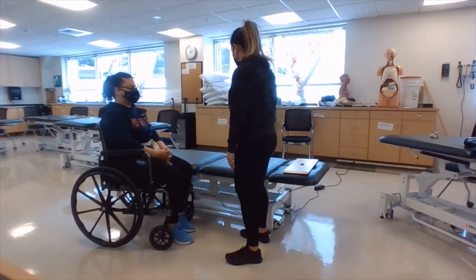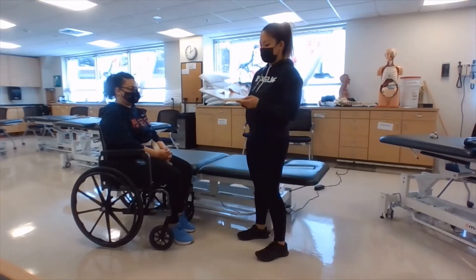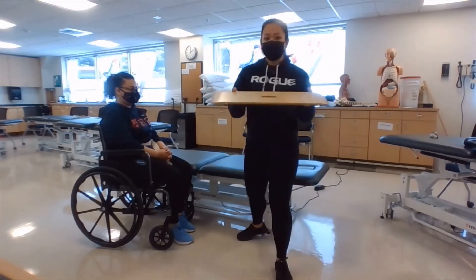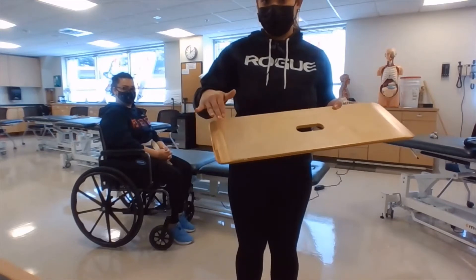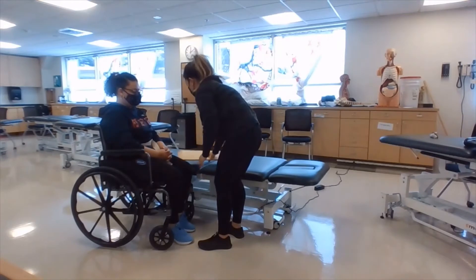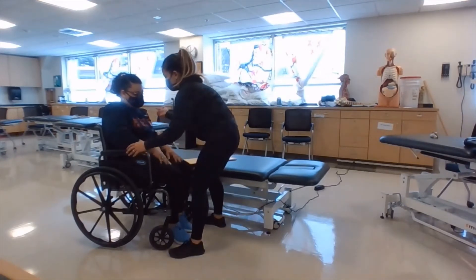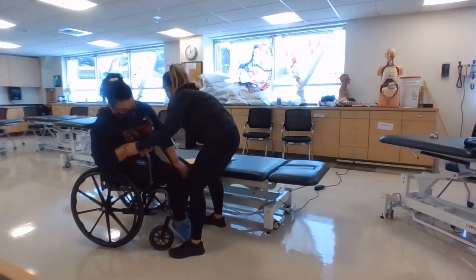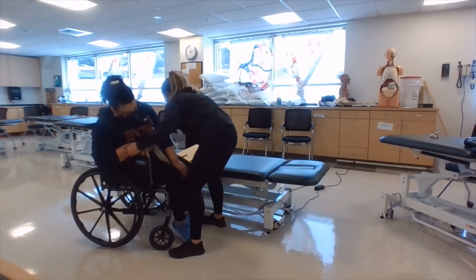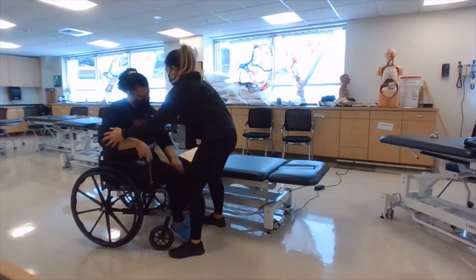The first thing we're going to do is get our slide board, and the way that you want the slide board is the tapered side facing up. Then I'm going to position it by having the patient lean this way, and I'm going to tuck about one third of it under their bottom, with the rest of it on top of the bed. Now she can relax.